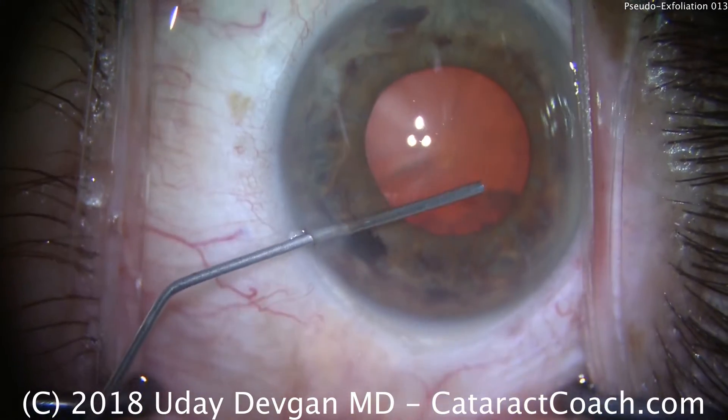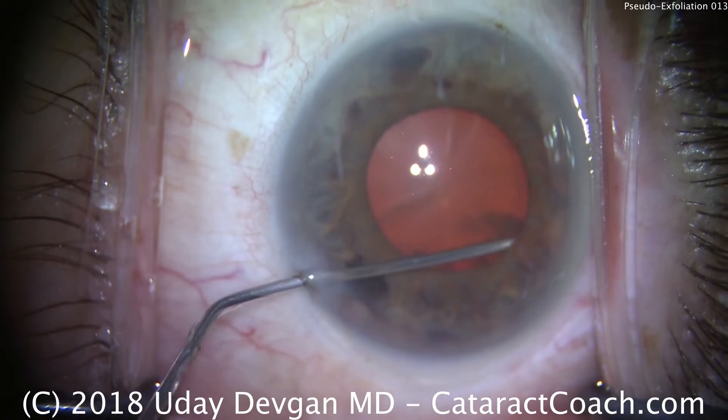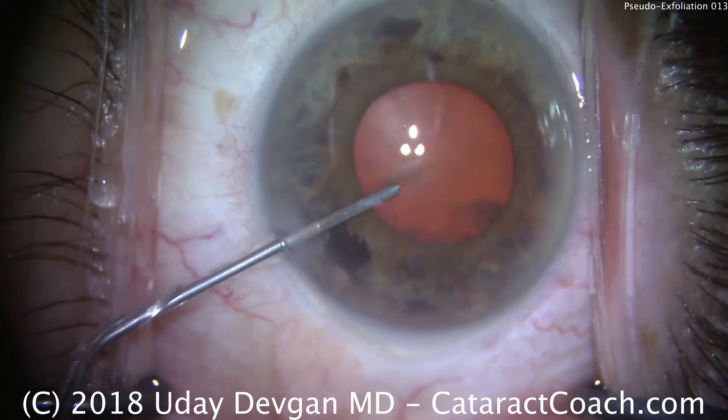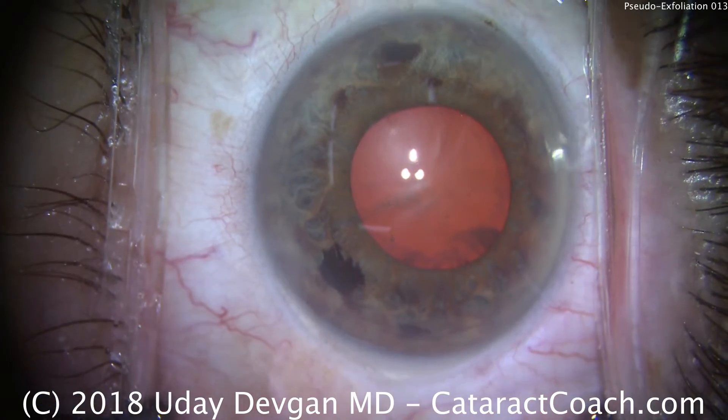It's Dr. Devgan, your cataract coach. We have a case today of pseudoexfoliation. We'll start by putting anesthetic under the iris. You can also put some mydriatic agents, and that should help expand the pupil a little bit.